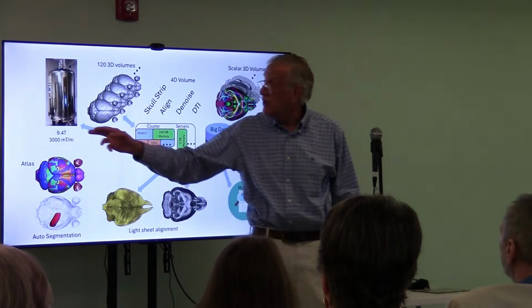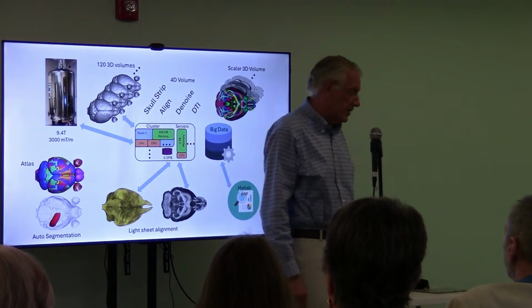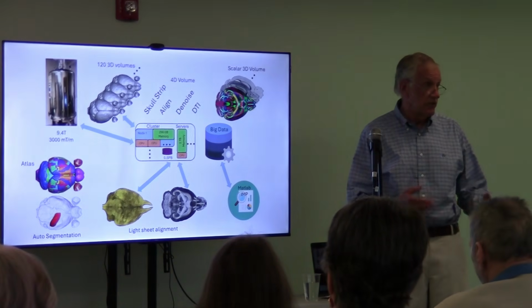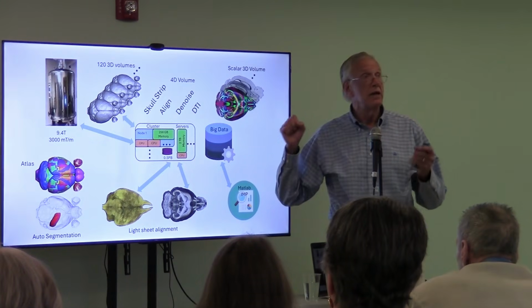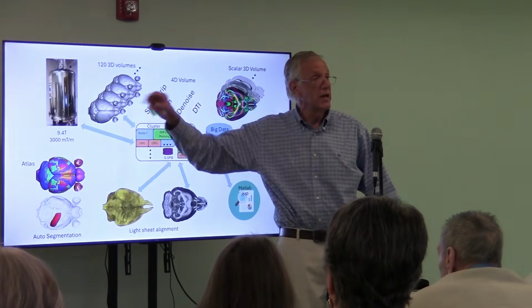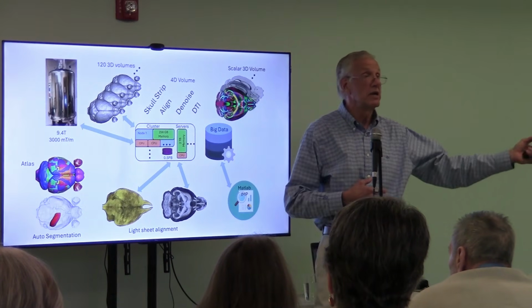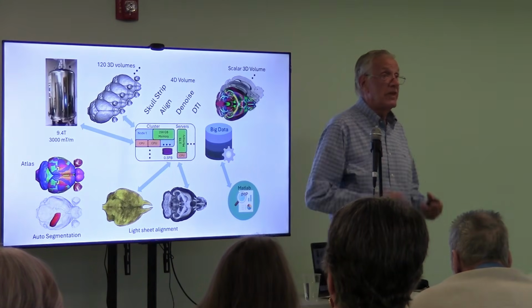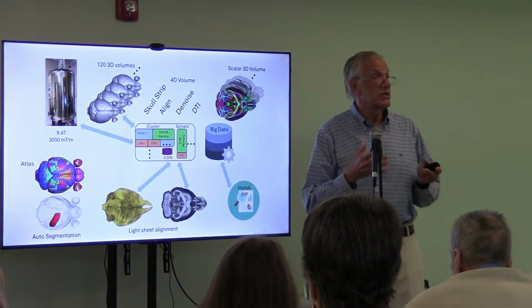And I have this computer infrastructure with something called a cluster. Each cluster has 20 or 30 nodes. Each node has 20, 30, 40 different processors. And so I can say, computer, just keep things running. Scan me one scan, then do the next scan. I can go off and have a cup of coffee. I can go home. I can have dinner. I can go to bed. Come back the next day, and it's gathered 120 volumes. That all gets automated. The next thing that happens is we have to process it like crazy.